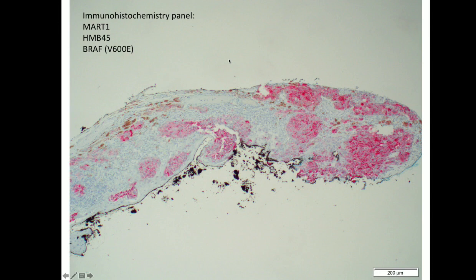And our panel, we usually have a protocol for conjunctival melanoma, which includes 2 melanocytic markers and BRAF. So we can actually have a look at the protein that's produced by this specific BRAF mutation to see whether it's there or not. It doesn't tell you anything about the other BRAF mutations. And this happens to be HMB45. In pigmented lesions like melanomas that are brown, we tend to use a chromogen that's red so that we can distinguish that from the brown that's in the background.